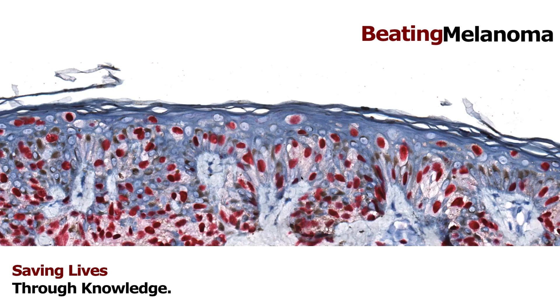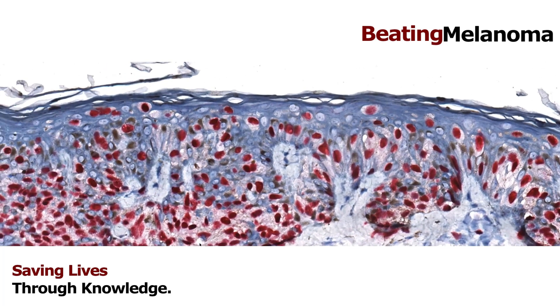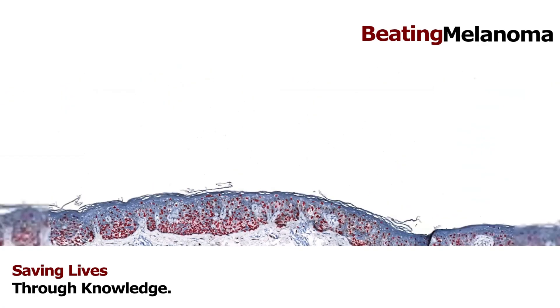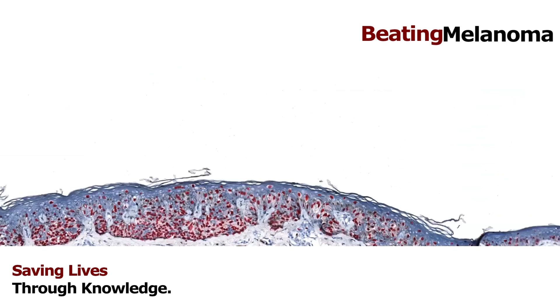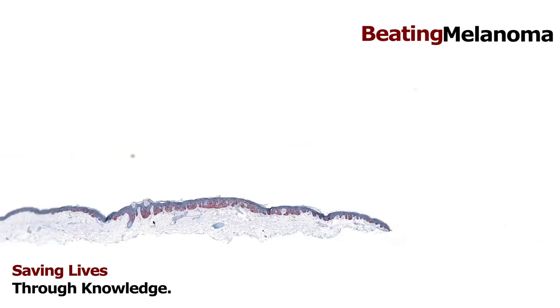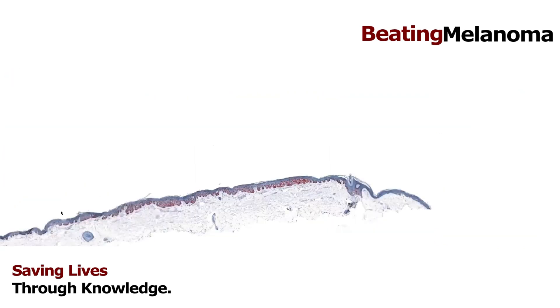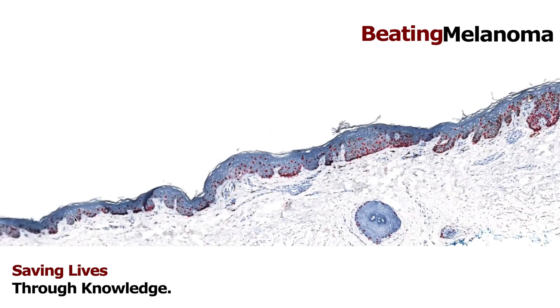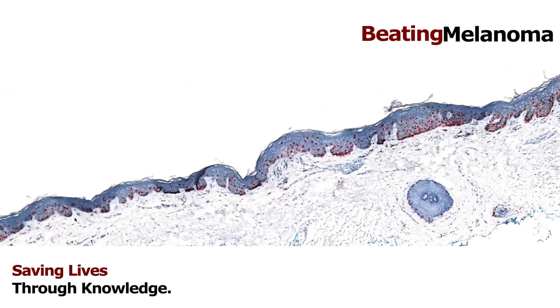Deciding what's enough to make a melanocytic lesion malignant is really complicated — there's no single specific feature. It's a combination of all the patterns together, put together with the clinical situation: what kind of skin it is, whether there's sun damage or not. You can't simply look and say 'there's one cell at the top, it must be melanoma.' In this case, in the sun-damaged skin of an older person with numerous melanocytes trickling up and scattering toward the top, that's a bad sign.